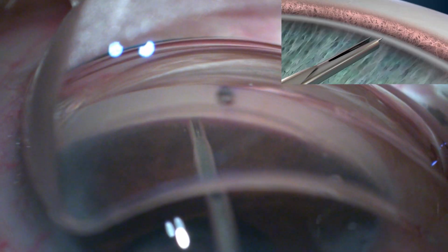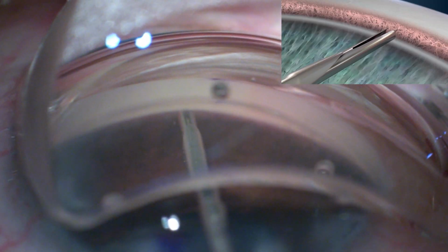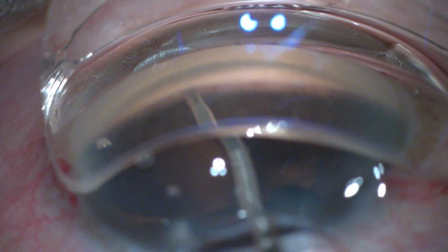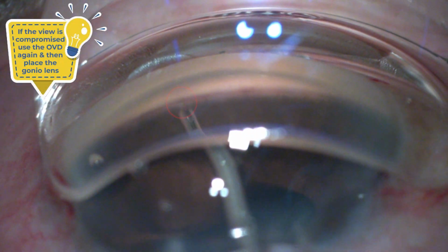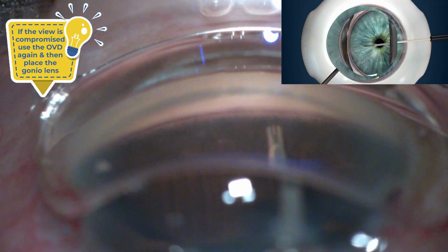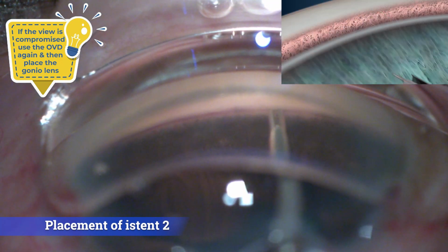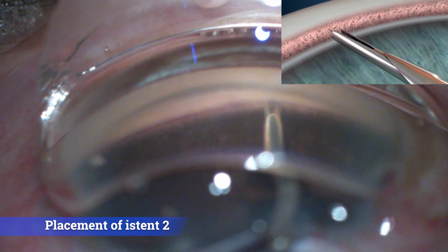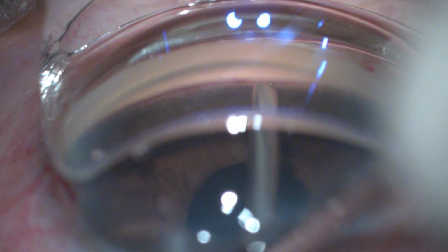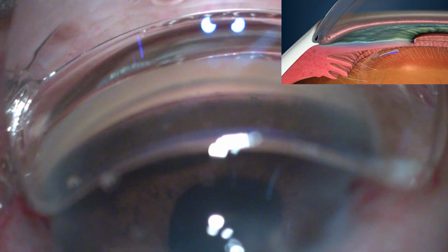The tip of the injector is then used to tent the area of trabecular meshwork with trocar, and then the device is injected by pushing the black button. The trocar and the injector is then withdrawn, keeping the black button pressed. The second stent is placed 2 to 3 clock hours away from the first one in the nasal angle. After implanting eye stent, it can be nudged with trocar to ensure it is well implanted.